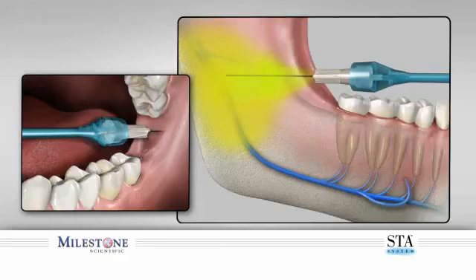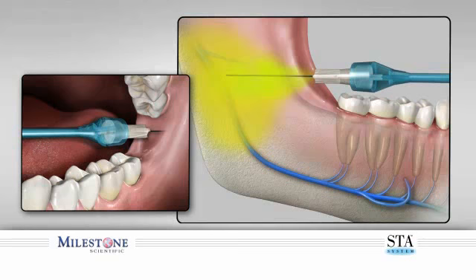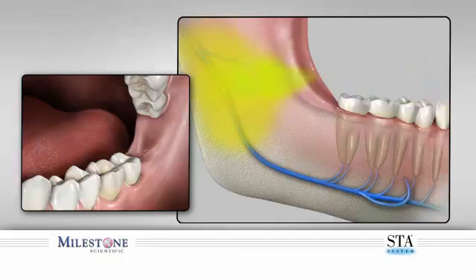When you have delivered the required dosage, you can remove the needle. To avoid anesthetic solution sprayback into the patient's mouth, perform the following. While the needle is still embedded in the patient's tissues, depress and release the foot control pedal. Count 3 beeps after releasing the foot control, then totally remove the needle from within the patient's mouth. Direct the needle away from the patient as a small amount of anesthetic solution may still be present. Should you require more than 1 anesthetic cartridge, you can reload subsequent cartridges and continue as required. Please see the section on multi-cartridge technique.